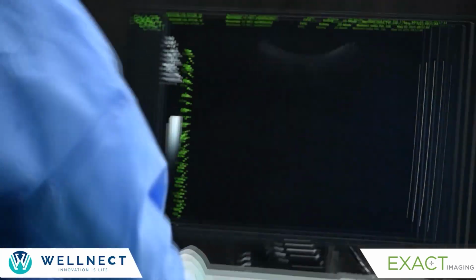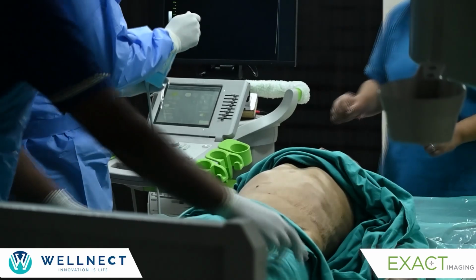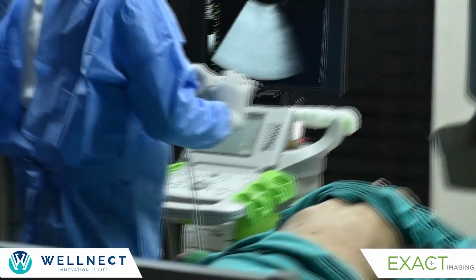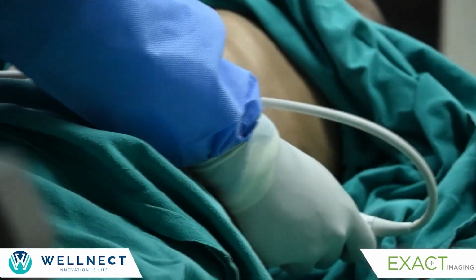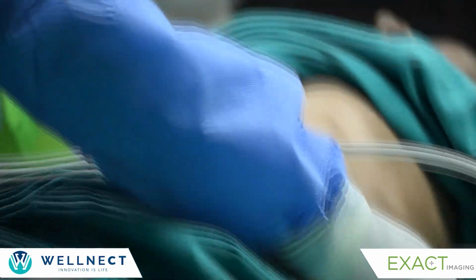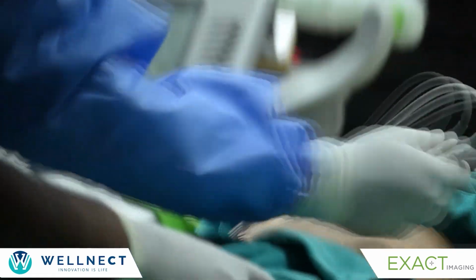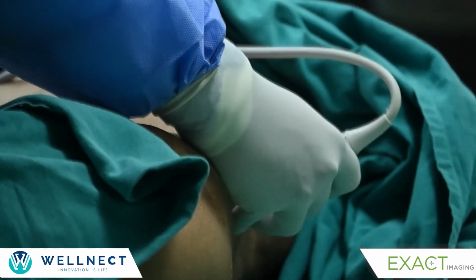Now we will go to the left side. As I said, the left side is slightly challenging. If that does not work, then you have to ask the patient to tilt towards your side, and again you have to go. So this is the screen which is seen. I still cannot see the kidney. So what I will do is discover the kidney. Especially this is required when the patient is still. So you have to take efforts. Now this is what you can see, the kidney.